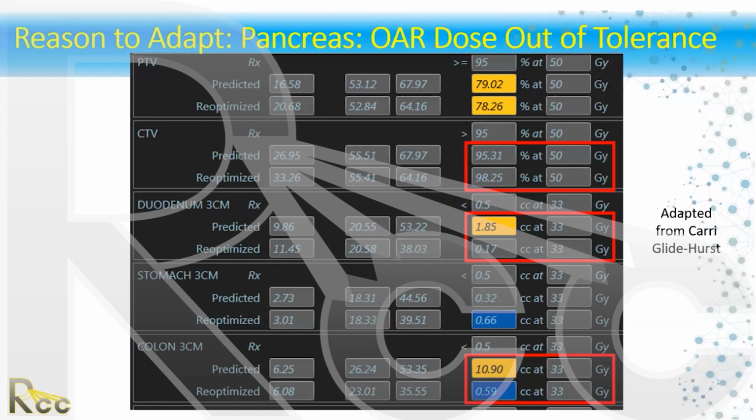With regard to the second question, the time, yes, the time is a factor. So there have been a couple of publications, one that we just put out, looking at the time for adaptation. So meaning in that 40 minutes that the patient's on table, from the time that you start the adaptation till the time you treat, is there any change in the anatomy? And what we found was the paper out of Memorial Sloan Kettering showed actually it wasn't significant. They looked at 10 or 15 pancreas patients on their Unity system, and they did imaging at multiple time points: right at the start, right before treatment, and then right after treatment. And they found there was very little clinical effect on the actual changing anatomy.